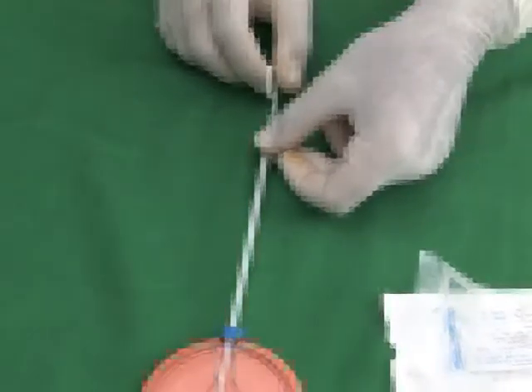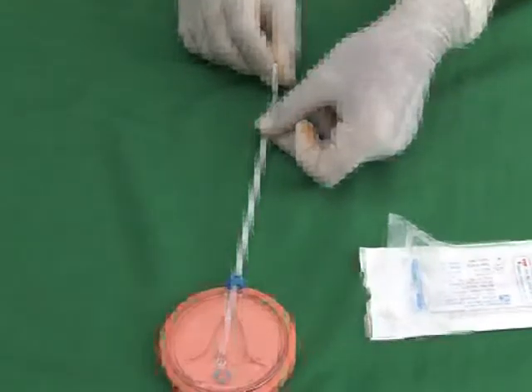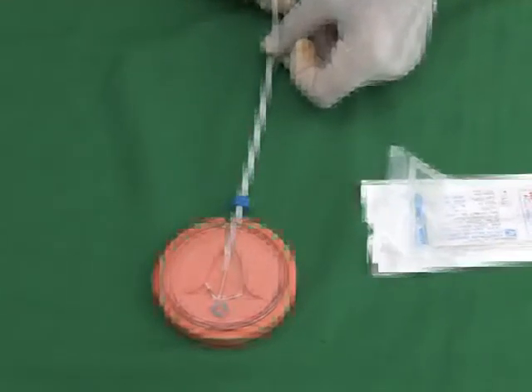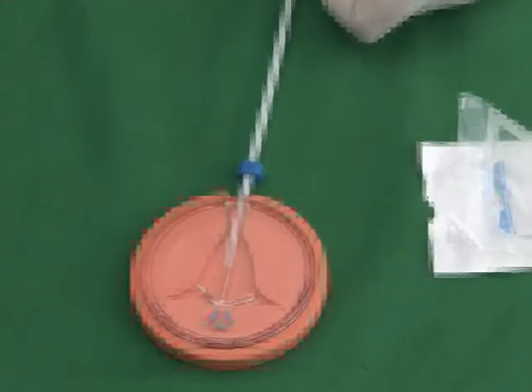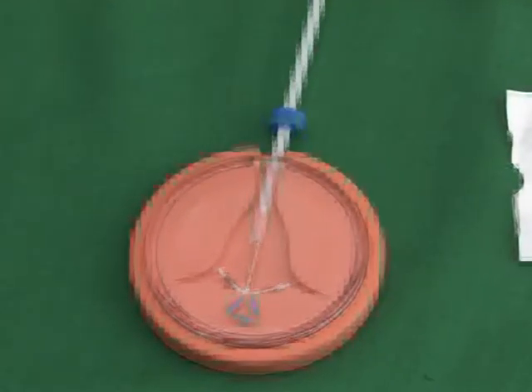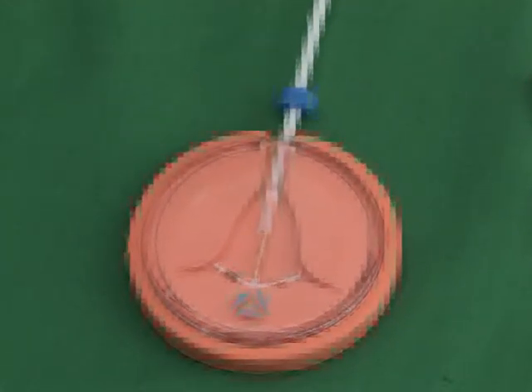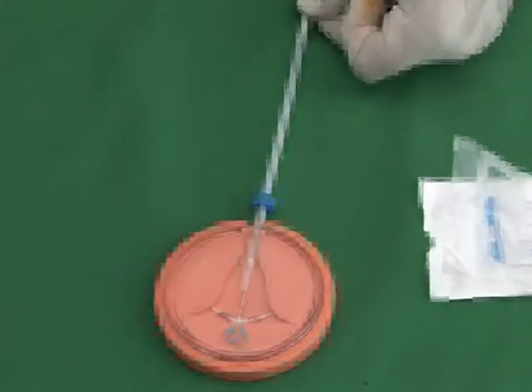Now you steady the inner rod and withdraw the outer clear tube up to the handle of the inner tube. While you are doing this, the horizontal arms will get released. Then you need to steady the outer tube and withdraw the inner rod completely.